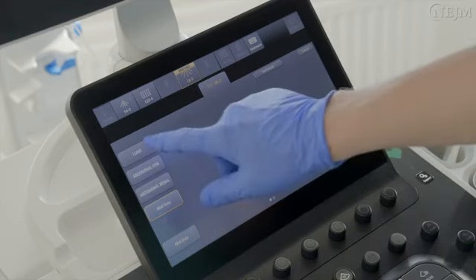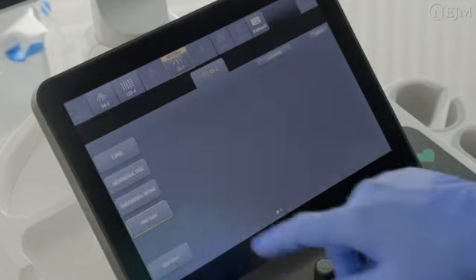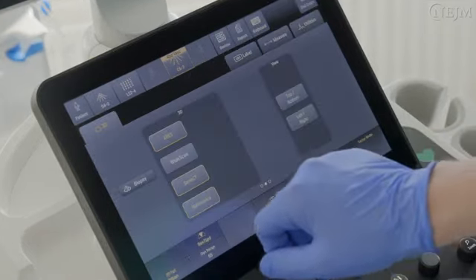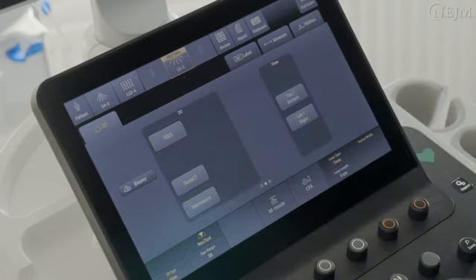Select the lung preset setting on the ultrasound device, which will adjust the gain, depth, and focus to the levels used most commonly in lung ultrasonography. If this setting is not available, disable the image enhancement filters such as cross-field imaging, noise reduction, and harmonic imaging. These filters can reduce or modify artifacts and thus make image interpretation more difficult.